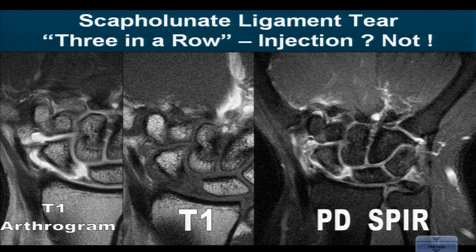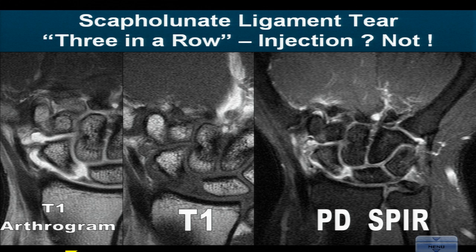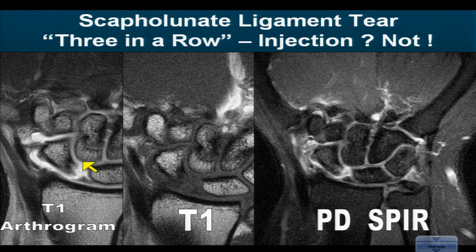Let's start with this triple image. On the left side you see an MR arthrogram where contrast has been placed into the radio-scaphoid articulation, just as it would be with any conventional arthrographic technique. You can inject any one of three compartments, but this is the most typical compartment injected. When we're looking at the intrinsic ligaments, we look for extravasation through the scapholunate or the lunatotriquetral interval into the mid-carpal space.